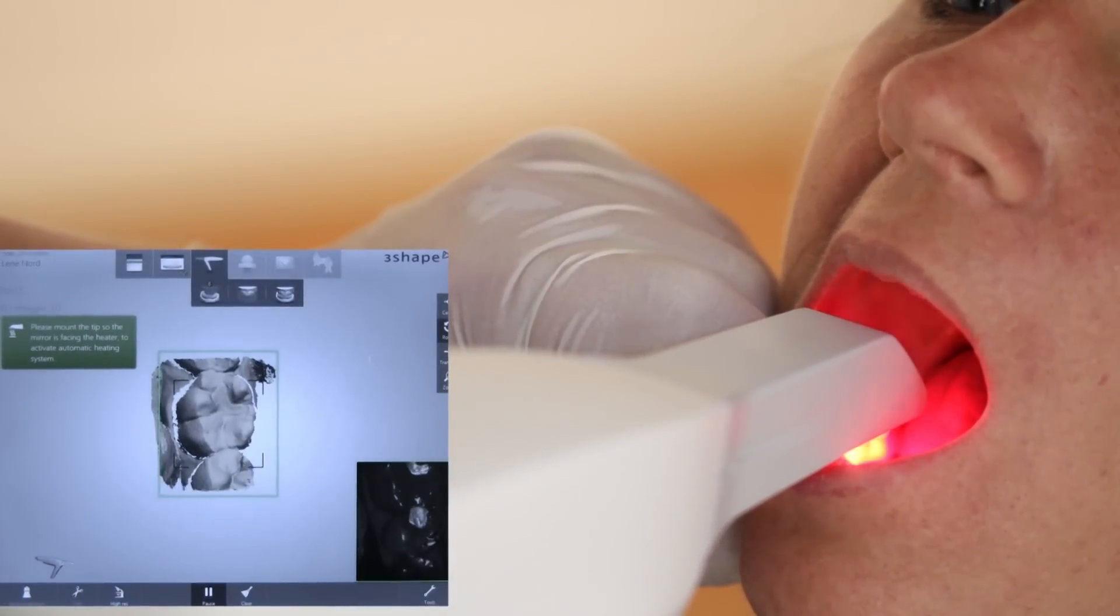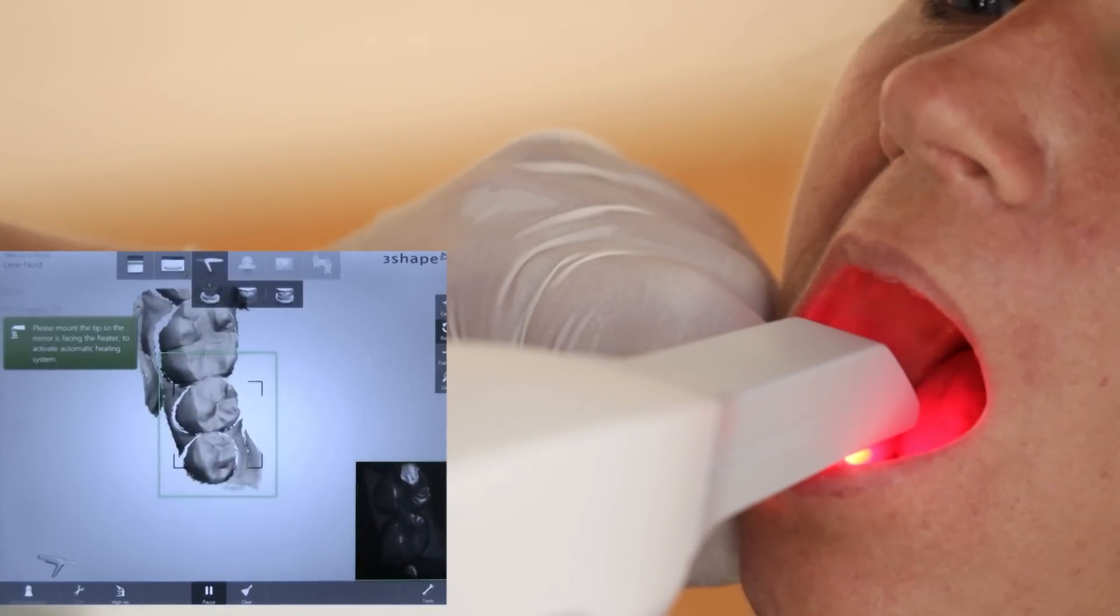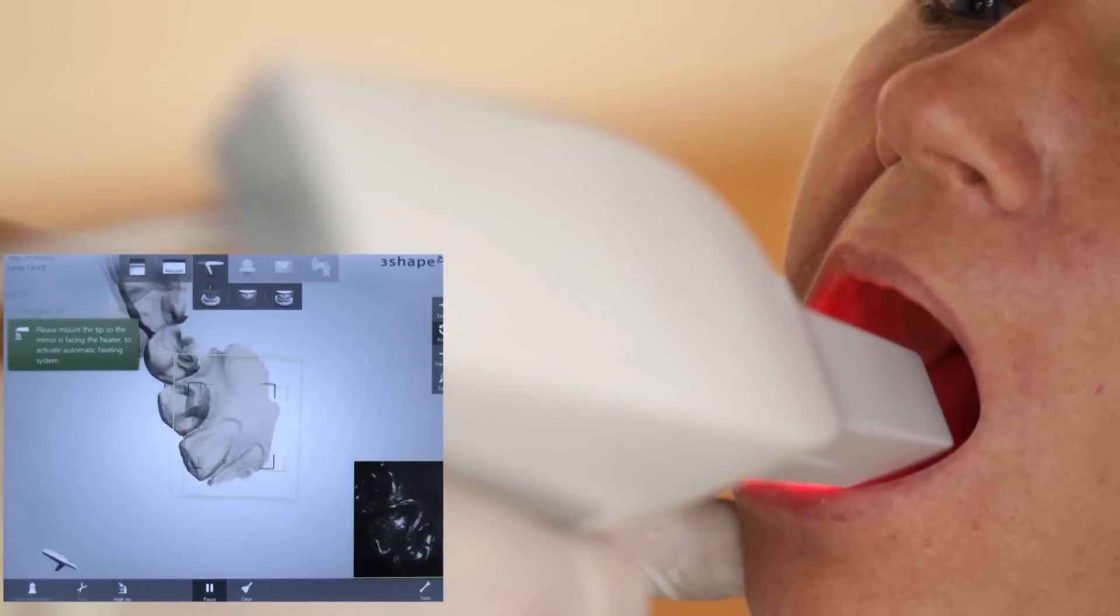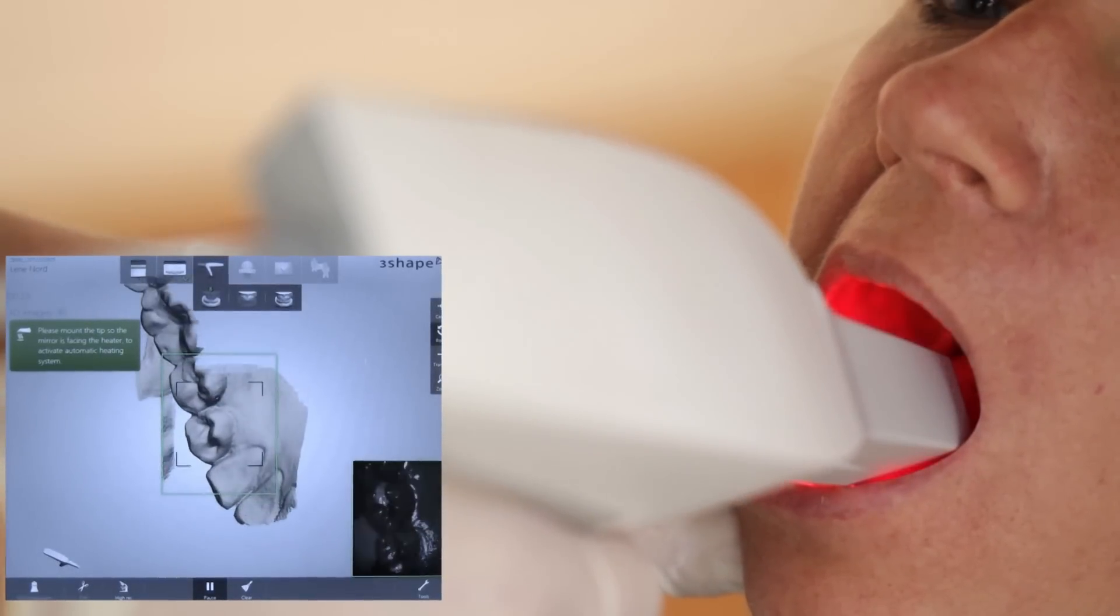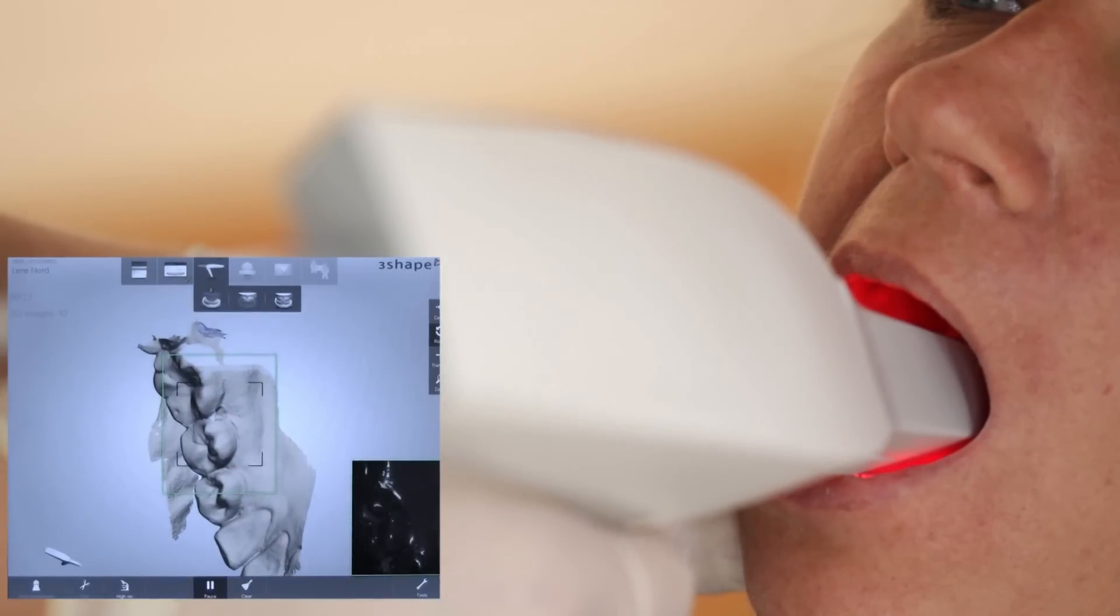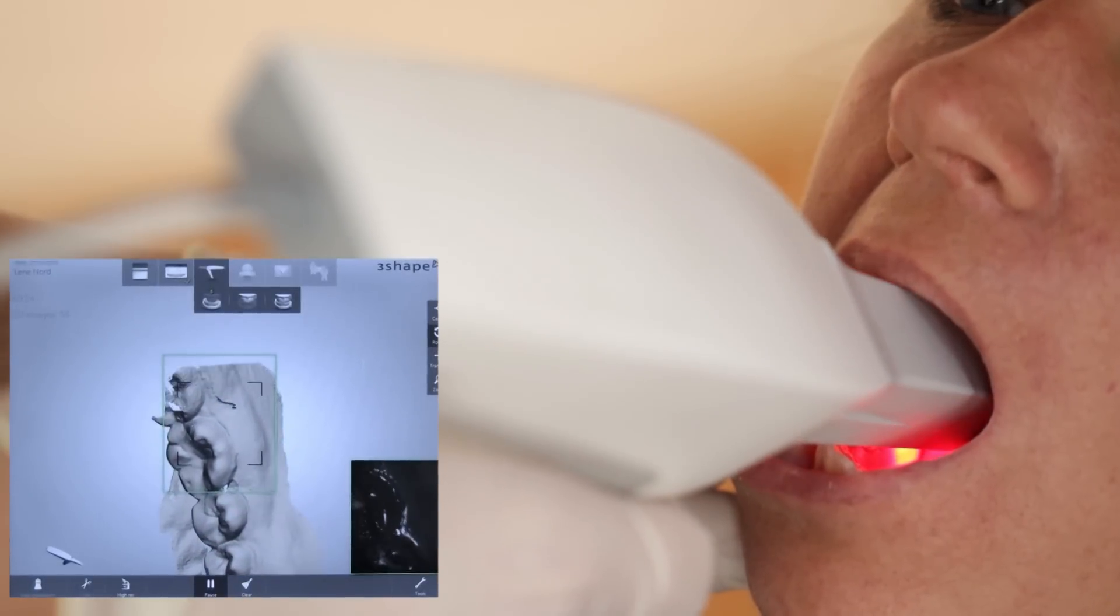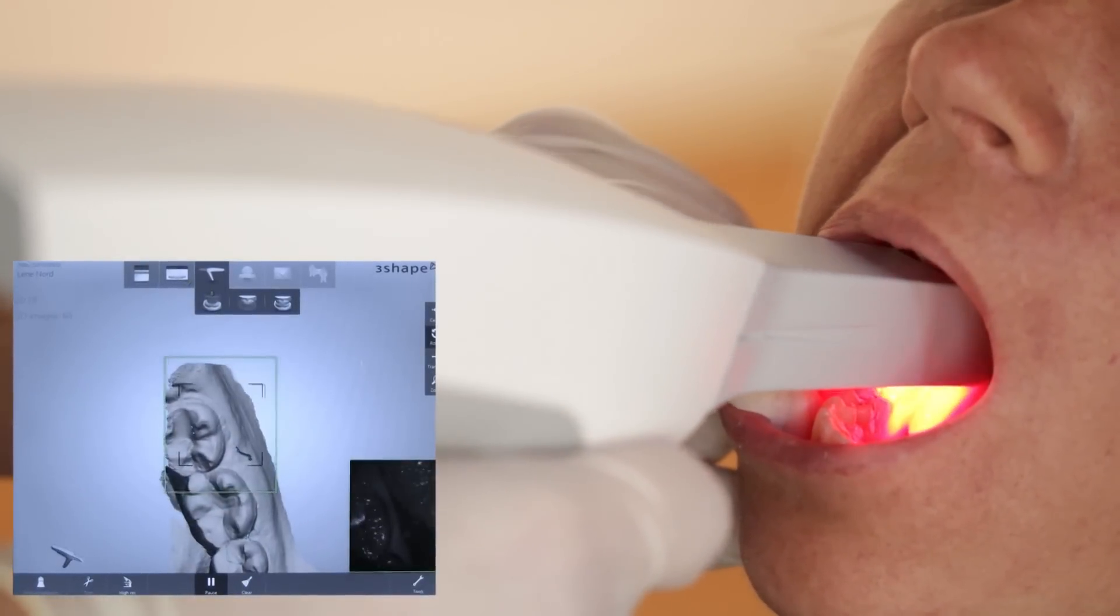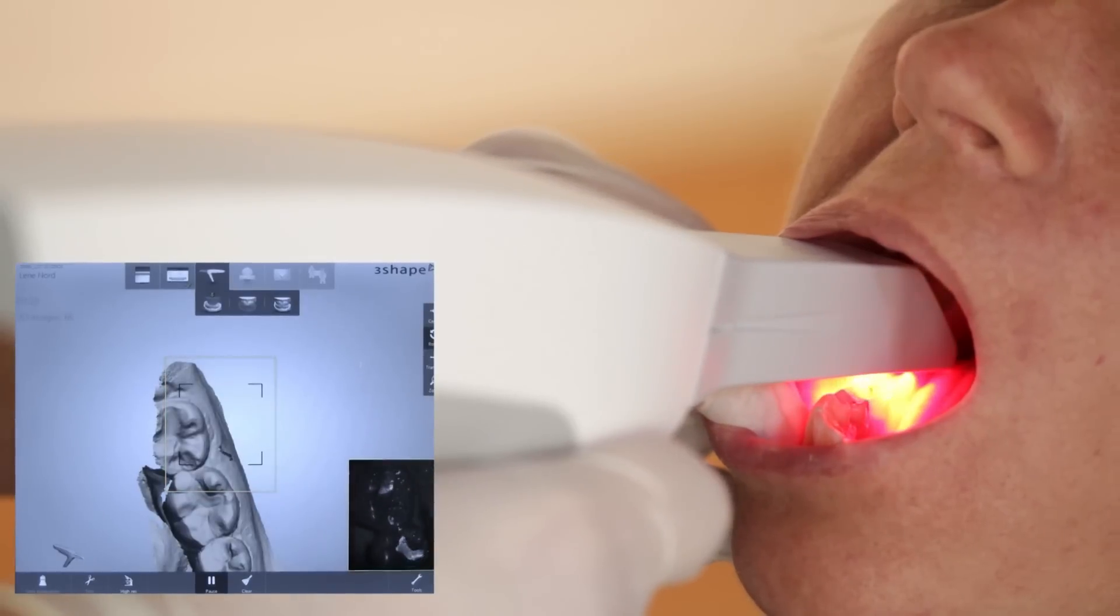Build the 3D scan on the screen as you gradually move the tip along the teeth. Proper stitching of the 3D data is indicated by a clicking sound so that the operator can continue looking into the patient's mouth during the scanning and know that data is being captured normally.